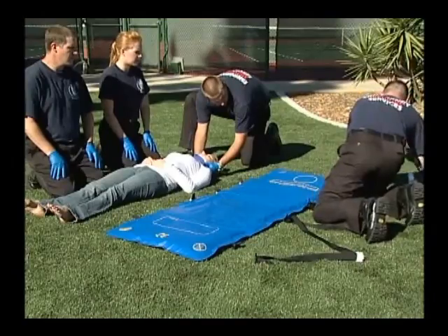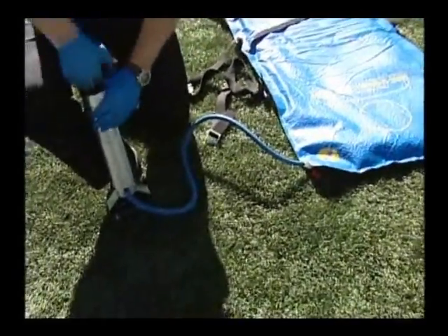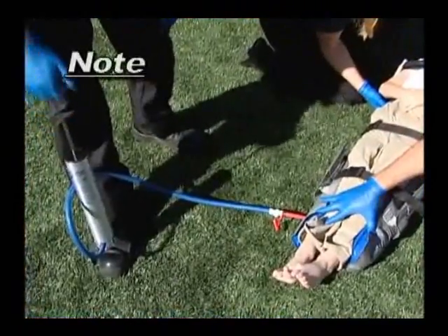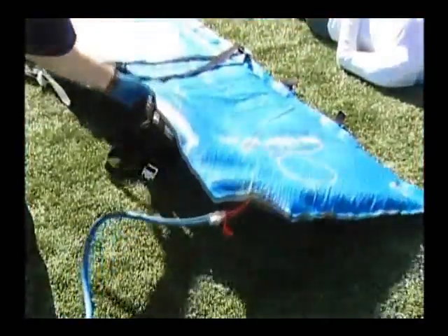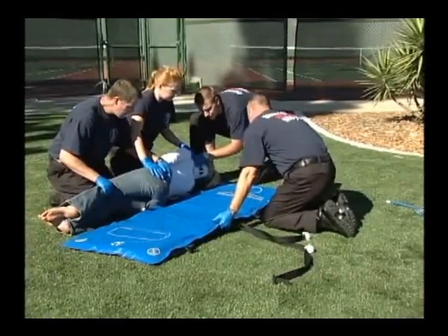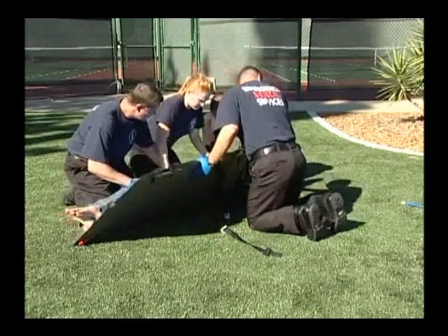Manually smooth out the beads to form a level surface. Connect the pump to the mattress by fastening the pump hose connector to the maxi valve on the mattress. The pump can be attached either at the foot end or the head end. Note: the pediatric evacuosplint mattress only has one valve at the foot end. Evacuate enough air to make the mattress semi-rigid. The objective is to be able to move the mattress as a unit during positioning and have the beads stabilized enough to place the patient onto the mattress without pushing the beads to one side.